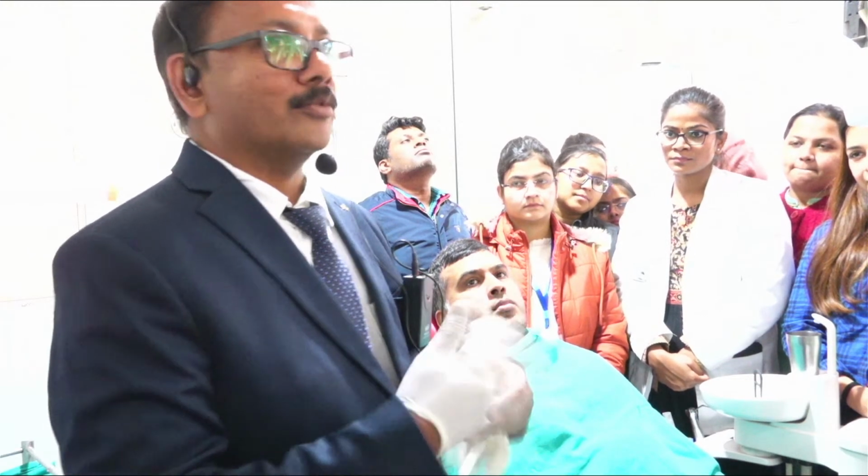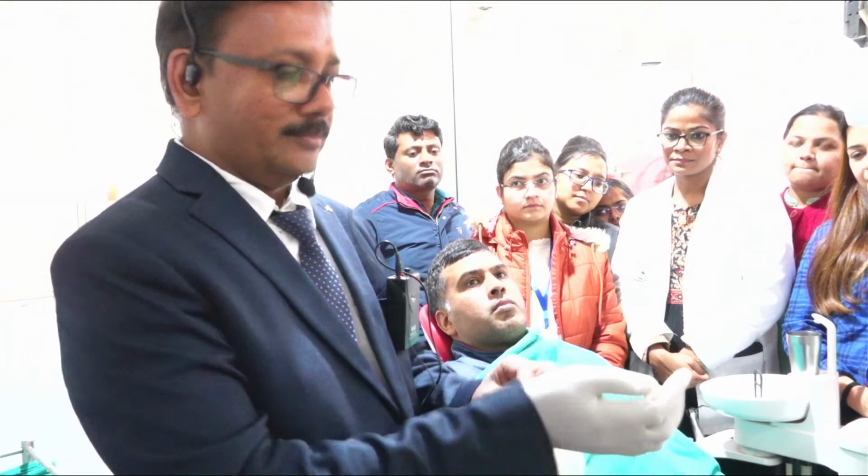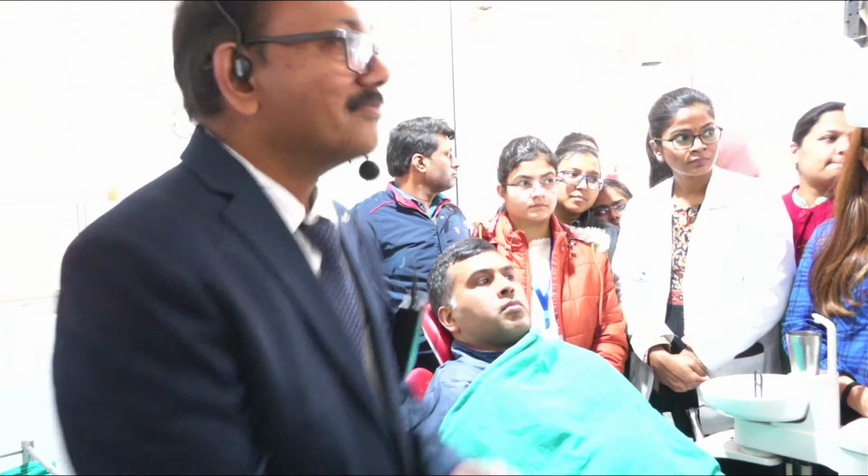So if the caries is a little deep, you can lase it and the dentin. Exactly.